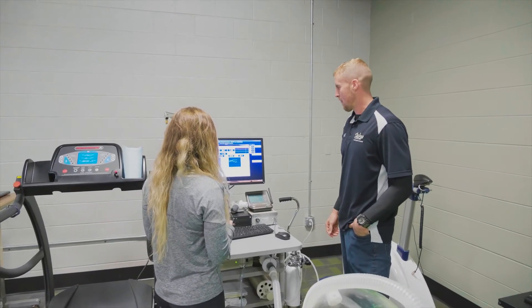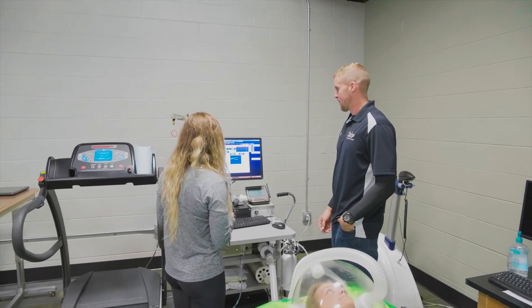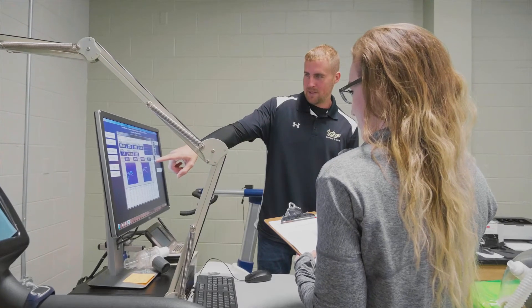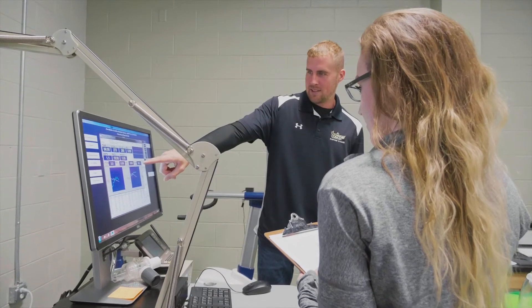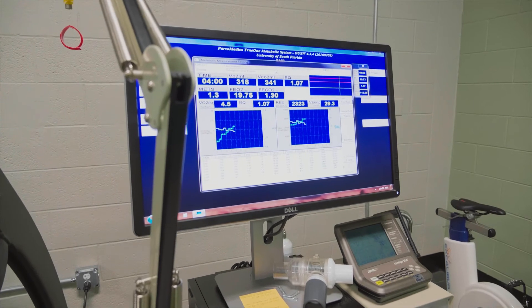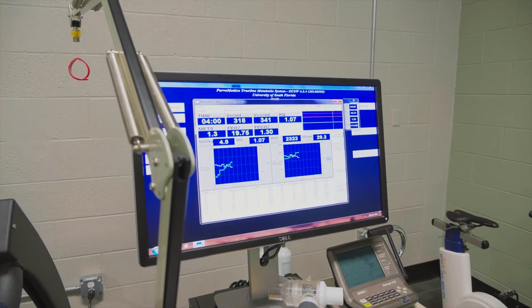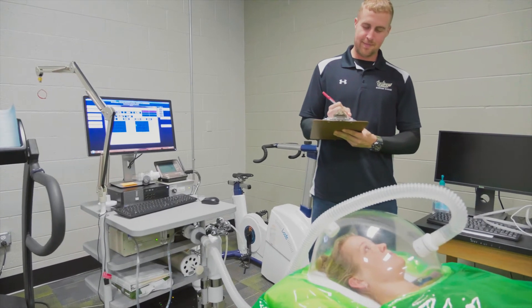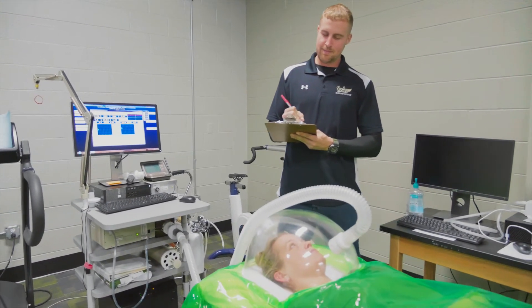RMR is a simple, non-invasive test that measures how many calories an individual spends at rest by determining the composition of their breath — so how much oxygen that person is consuming and how much CO2 or carbon dioxide that person is expiring. By determining the rate of oxygen consumption, we can determine that individual's resting energy expenditure.